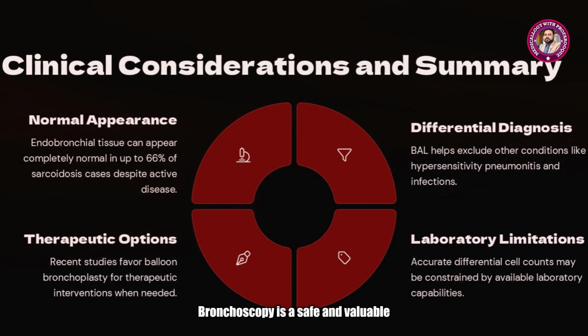Bronchoscopy is a safe and valuable procedure for diagnosing various lung conditions. Careful patient selection, proper sedation, and skilled technique are essential to minimize risks. Common complications include mild bleeding or temporary cough, while serious events are rare, with a high diagnostic yield, especially when combined with advanced techniques like EBUS. Bronchoscopy remains a cornerstone in respiratory diagnostics, guiding effective treatment decisions and improving patient outcomes.